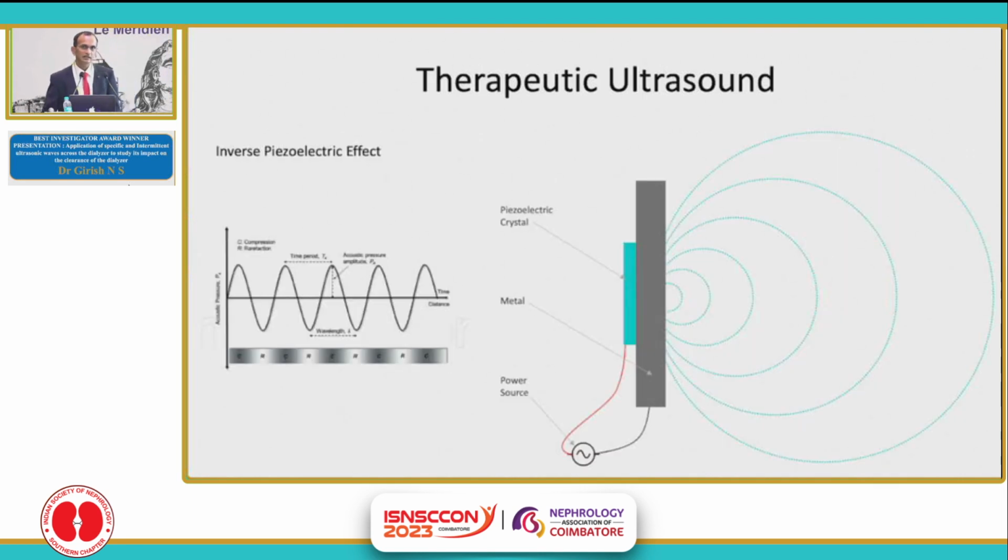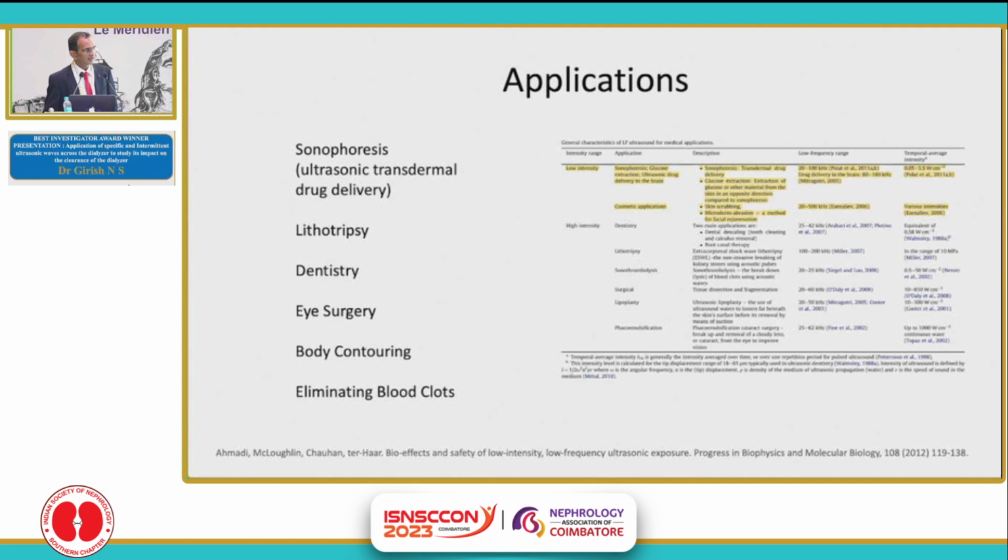The principle of ultrasound is conversion of electrical into mechanical energy through piezoelectric crystals. The concept is simple. You have a power source and then a transducer, and then you deliver pulsatile waves in the form of compression and rarefaction. We all know there are a number of therapeutic applications for ultrasound.